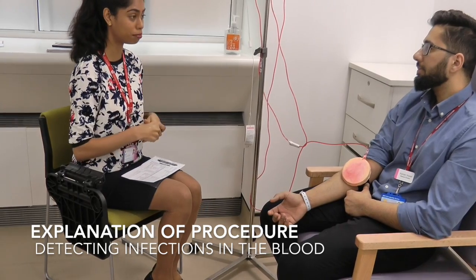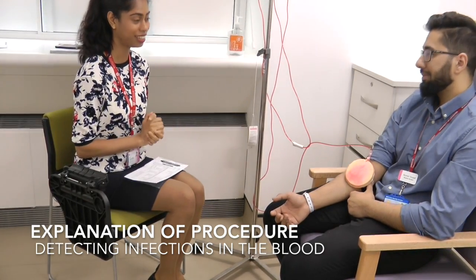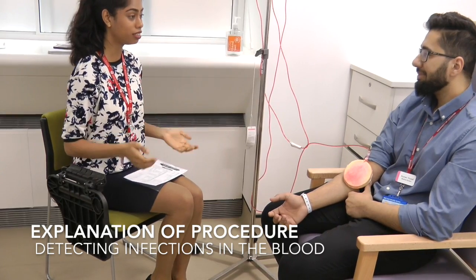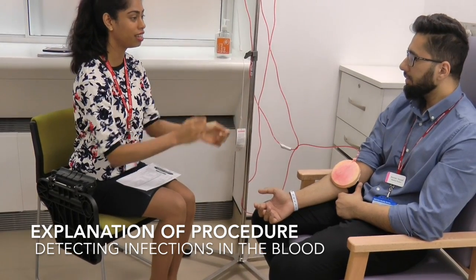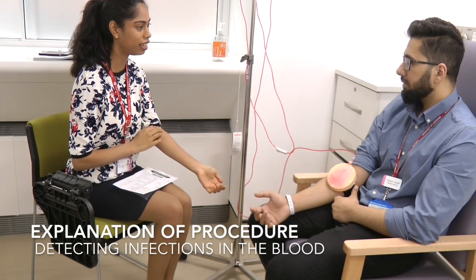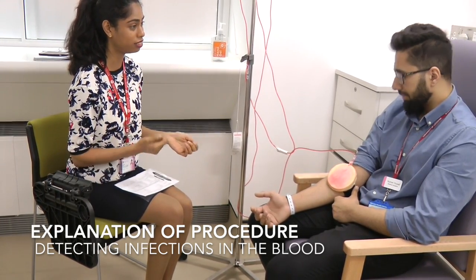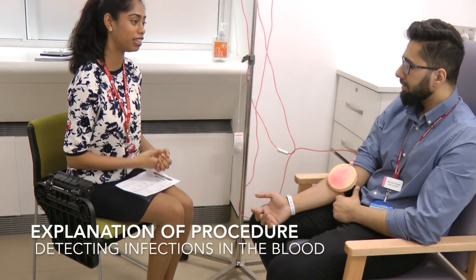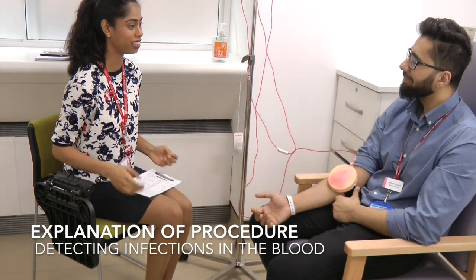Hi Neumann. So I've been asked to take some blood cultures from you today. Have you ever had any blood taken before? No. What it involves is just to take some blood — I'll first apply a tourniquet, have a feel for a vein in your arm, then clean the area, use a needle to get access to the vein and get some blood out. We can use that blood to identify if there's any infection in your blood. Does that sound alright?